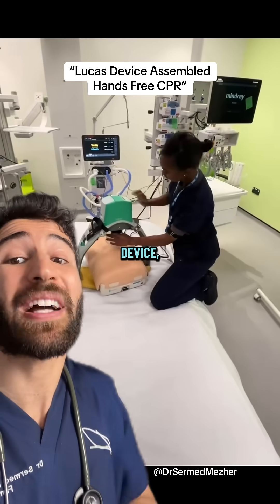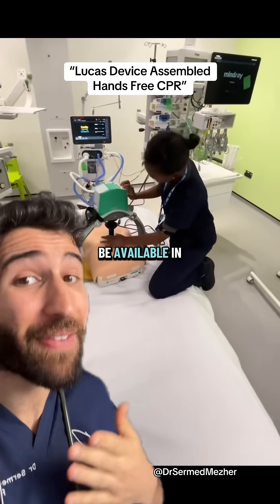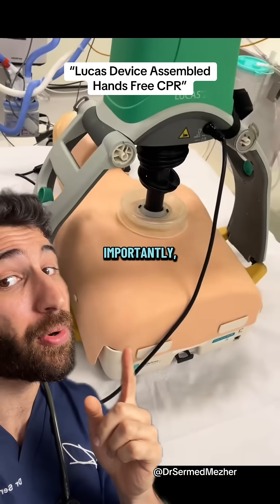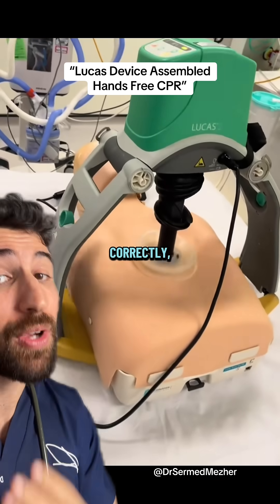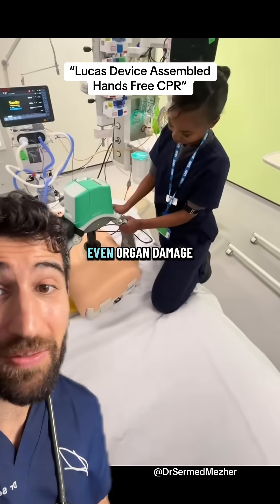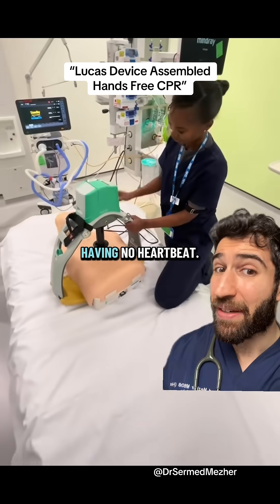There are different versions of the device, but with all of them: A, it needs to be available in the first place, for which your hands hopefully are most of the time. And B, more importantly, if it's not attached and installed correctly, then it can lead to ineffective compressions and potentially even organ damage — although so can having no heartbeat.